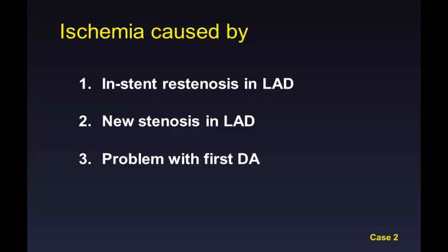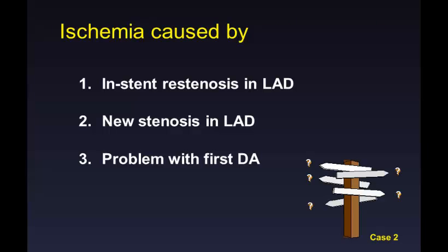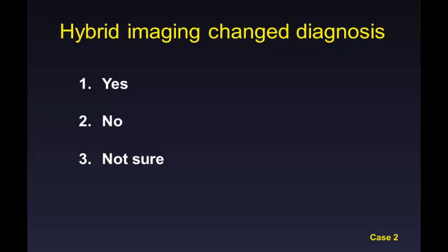I'm anxious to see whether there is any change in your evaluation. Fantastic. You saved my day, and also, maybe the day of the organizers. Let me know whether hybrid imaging has changed the diagnosis. Please vote 1 for yes, 2 for no, 3 for not sure.